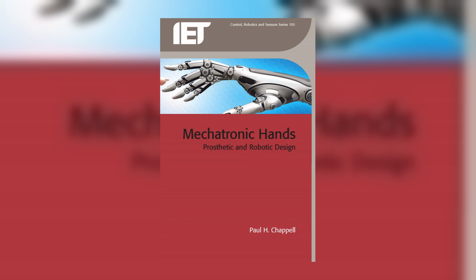Lighter materials, printed metals, and nanofilled polymers save grams. Smarter algorithms spend them better. Vibrotactile feedback closes the sensory loop without invasive cost. The primitive added function is never free. It is always priced in mass, in complexity, and in the wearer's cognitive load.